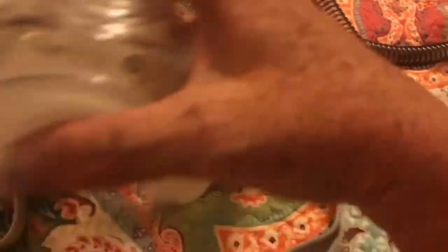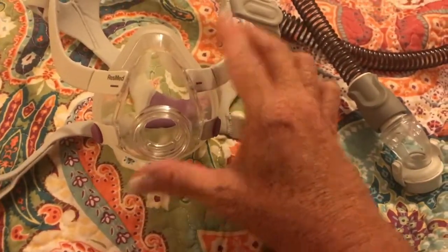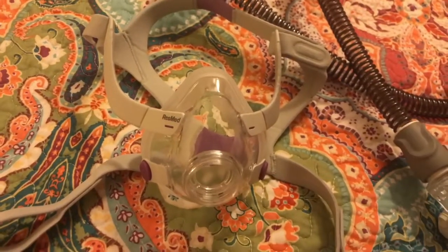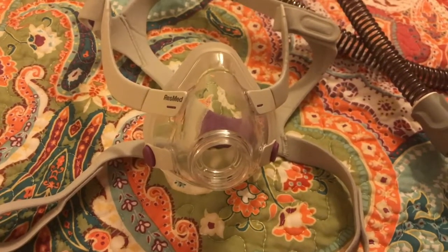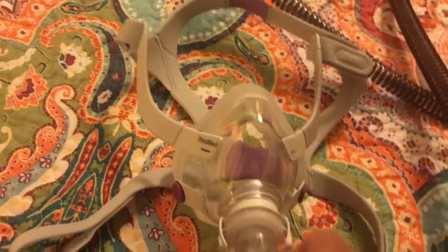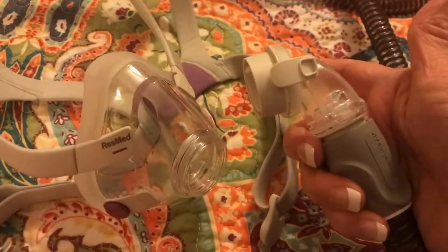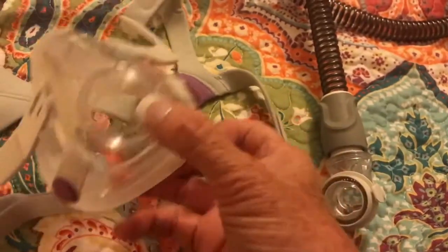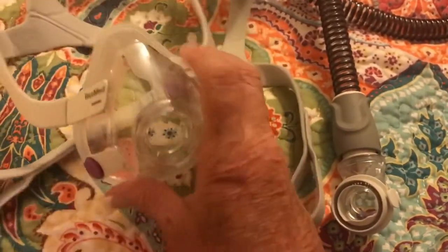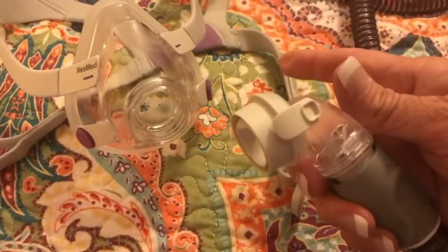One thing I liked about it is the hose goes right in here. She told me if I have to get up and go to the restroom — or if I feel panicky when I wake up, because that's been my problem — I wake up feeling like I can't breathe, get panicky, and rip the mask off. She told me don't rip the mask off. Instead, just unsnap this elbow piece — it stops the airflow into the mask, but there's still a hole I can breathe through to calm myself down. Or if I have to go to the bathroom, all I have to do is unsnap it. It's that easy.